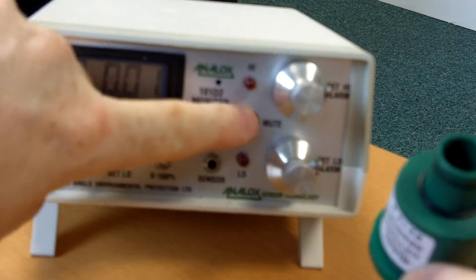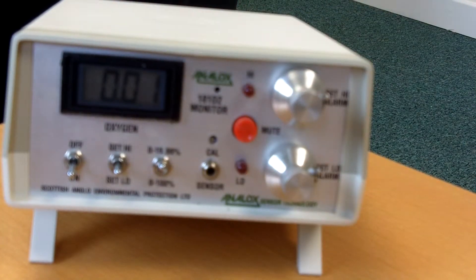The unit will alarm, so you can mute the unit. Remove the sensor to subject the monitor to no oxygen. It should read around 0.01.